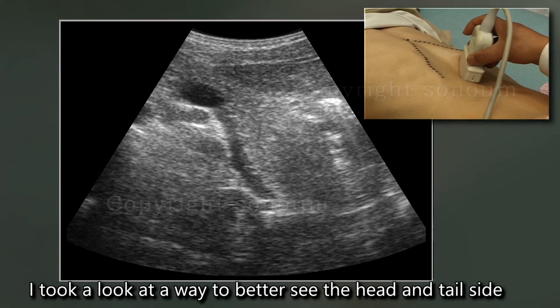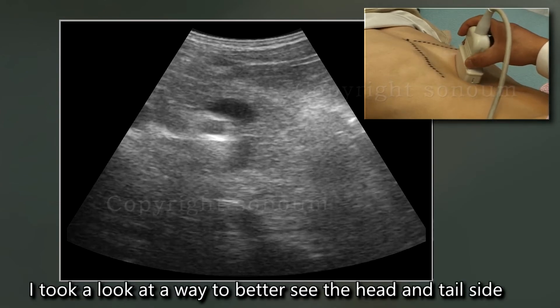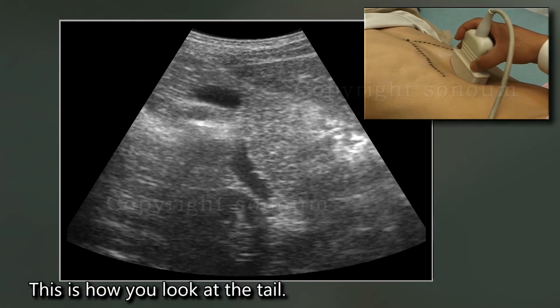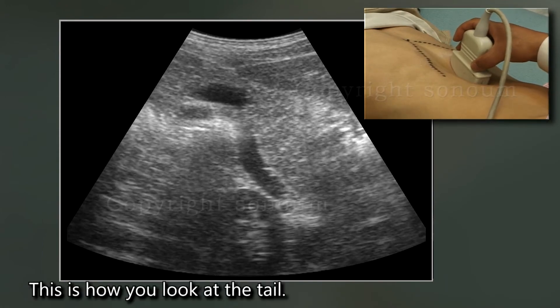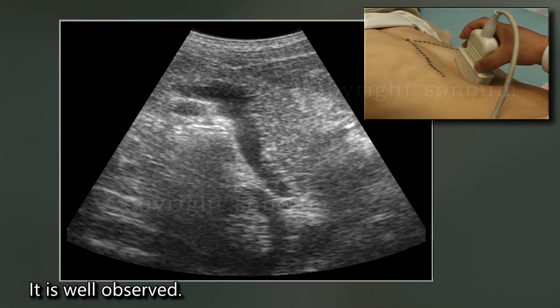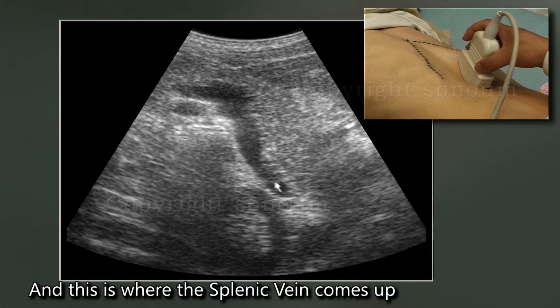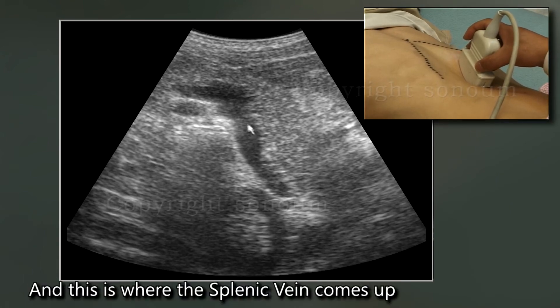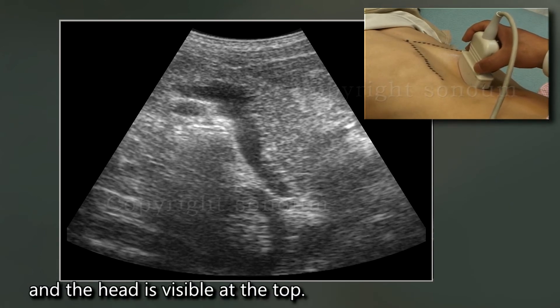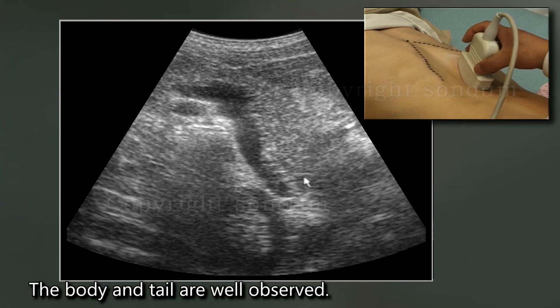I took a look at ways to better see the head and tail side while changing the position. Here you can see the tail well observed. Here is the SMA, and this is where the splenic vein comes up. The head is visible at the top, and the body and tail are well observed.